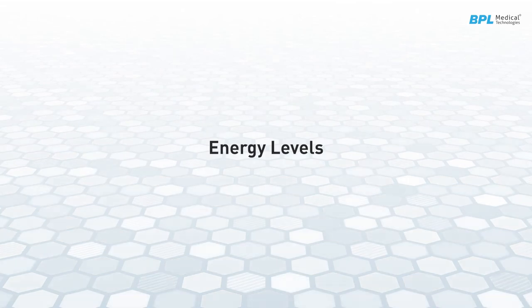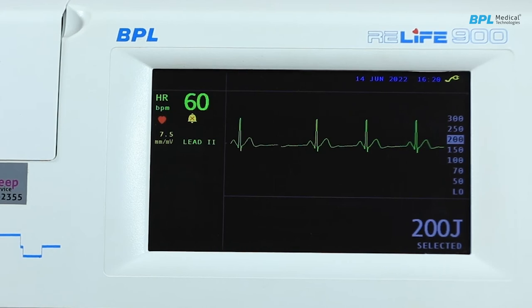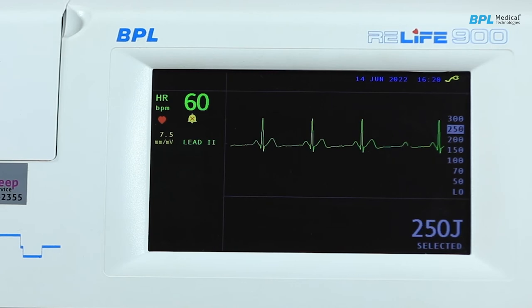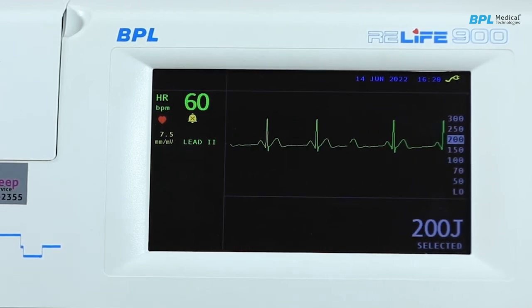Energy levels. This area shows the different energy levels. A menu showing the list of energy levels to be selected is displayed on the right side when the energy up-down keys are pressed. The selected energy level is displayed in bold digits.